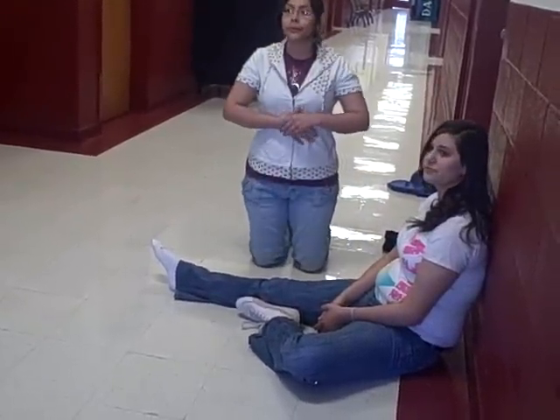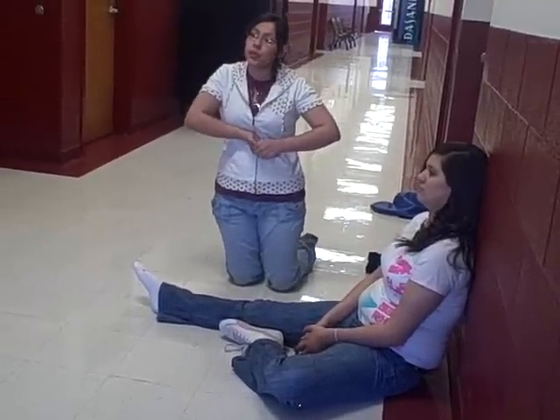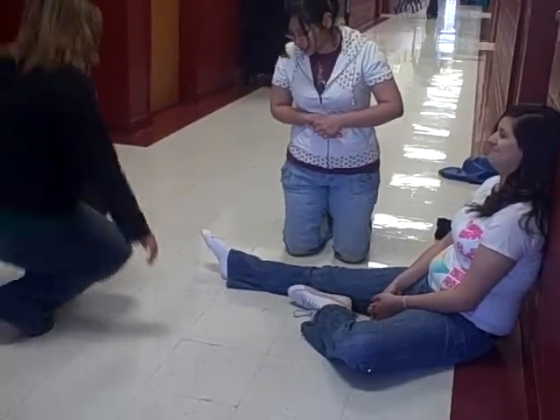Alright, I'm ready. BSI for my scene. I'll begin by asking my EMT assistant to immobilize the leg using manual stabilization of it.